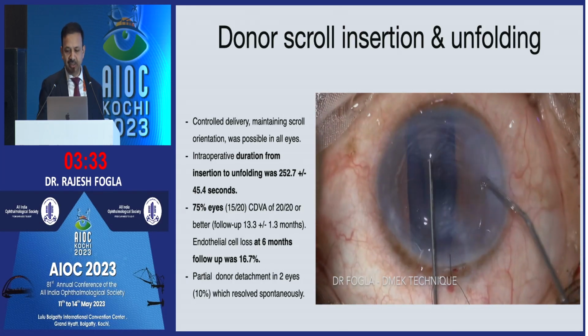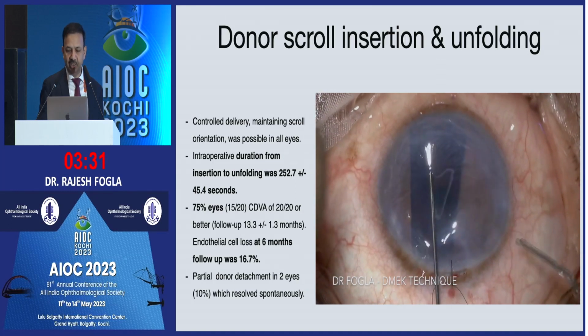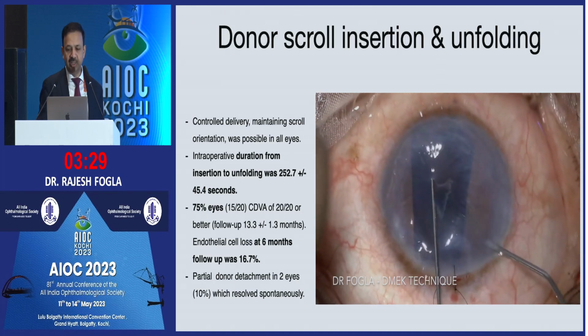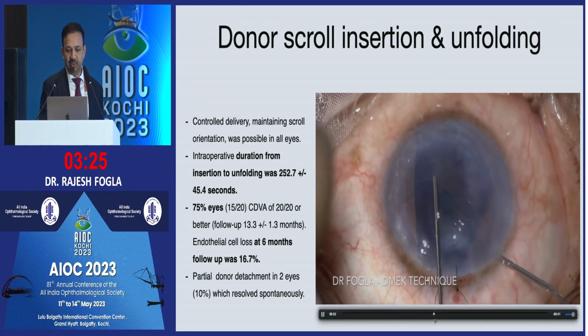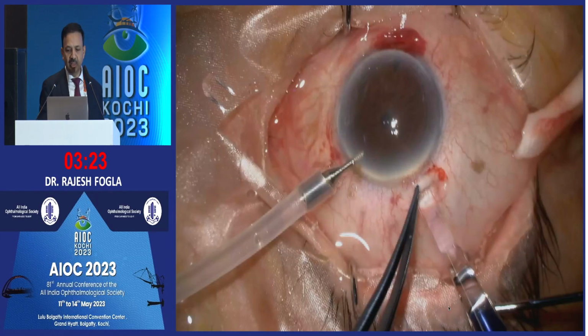I just secure the center, and as I tap the periphery on both sides, you can get the graft to open up, and then you can put an air bubble below the graft to complete the surgery. This is another similar case.